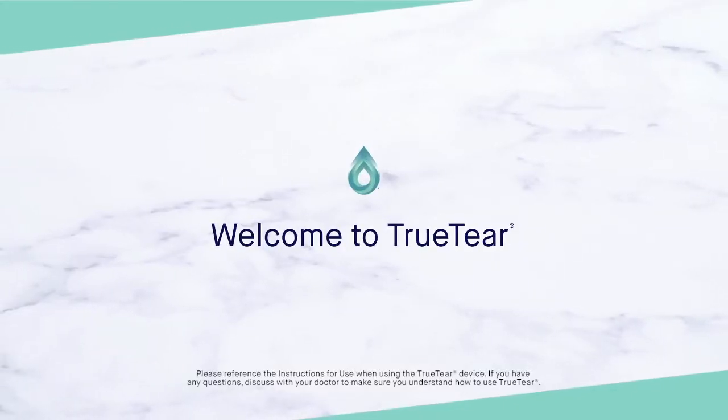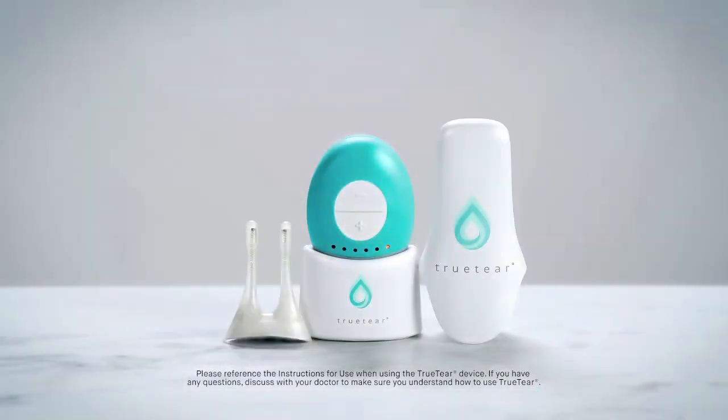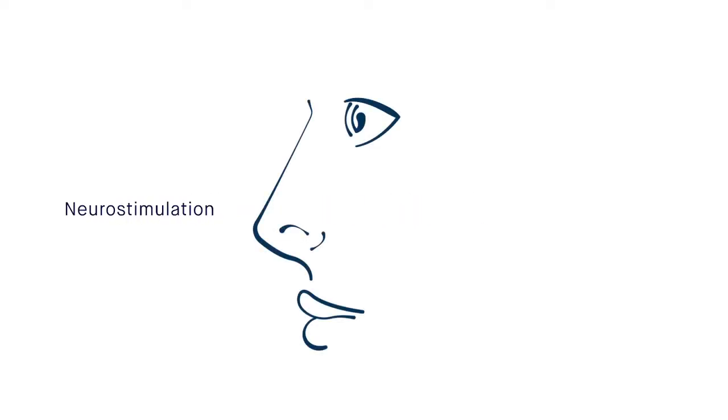Welcome to TrueTear. This handheld, drop-free, drug-free device uses state-of-the-art technology called neurostimulation to help your eyes make more of your own natural tears. If you're over 22 years old and have dry eye from inadequate tear production, TrueTear may be right for you.